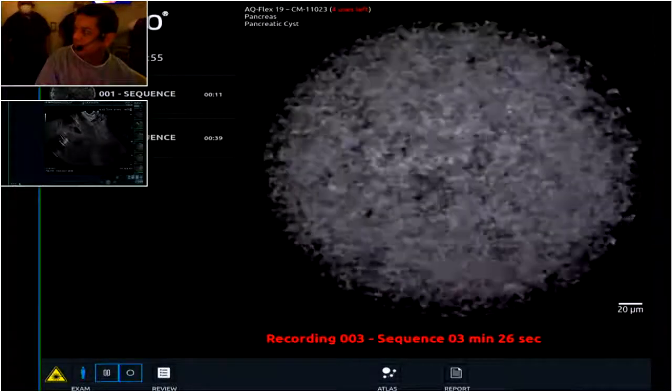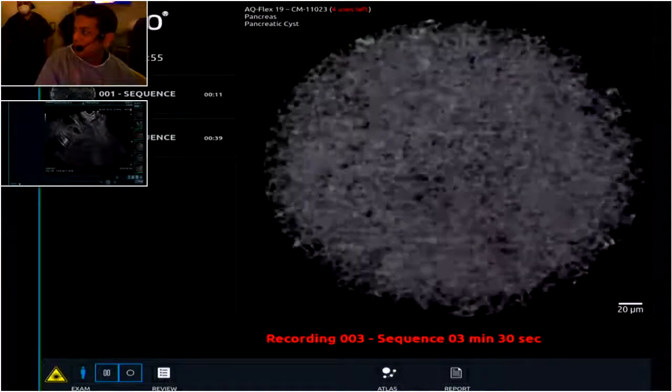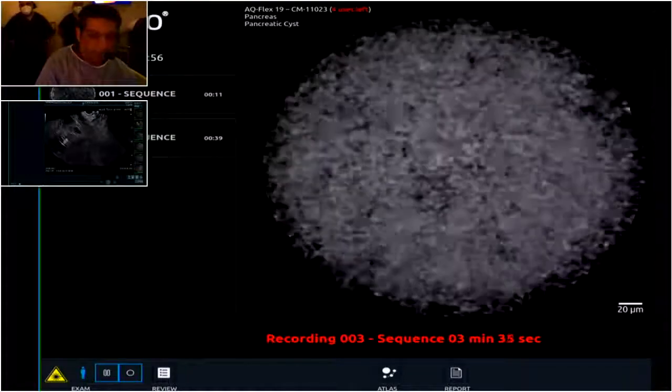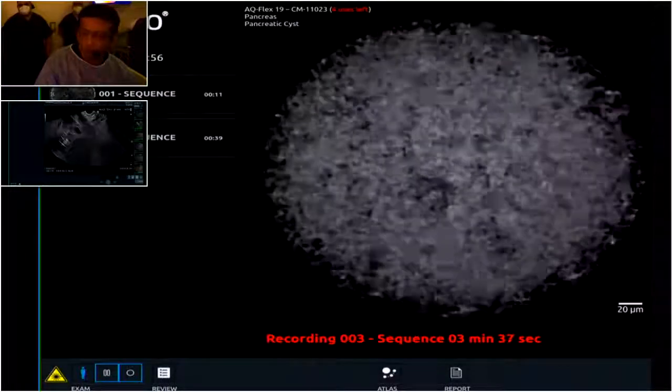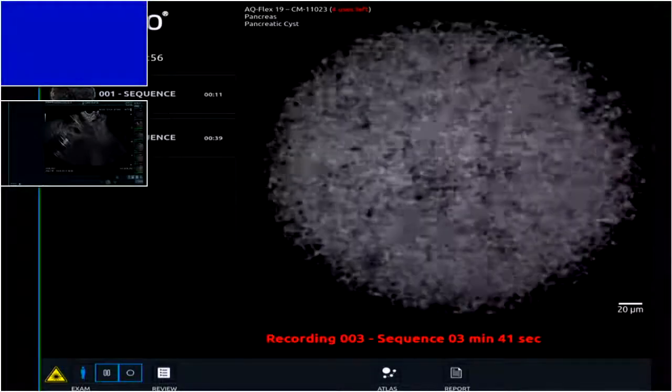Very interesting case. Interesting because the appearance at B mode on US can be confused. But I believe that today we have a very nice message.